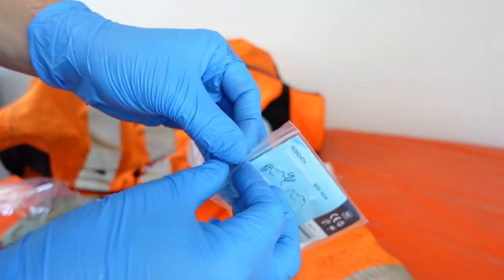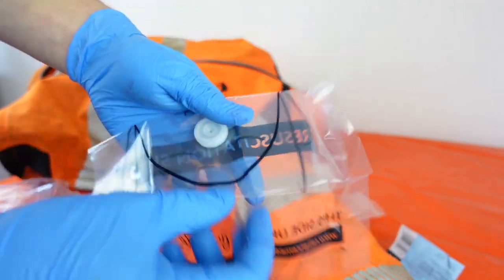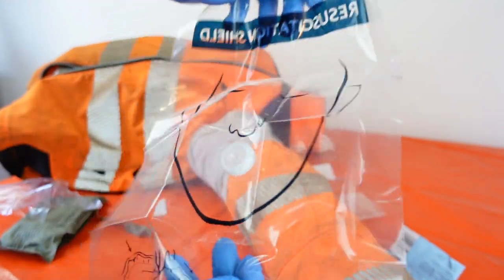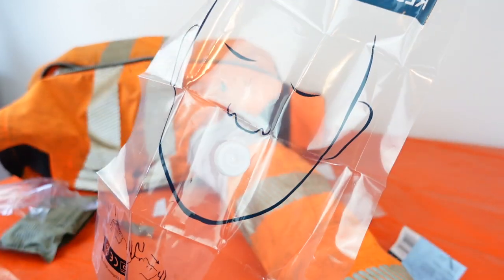The resuscitation aid is something I wouldn't have included myself, but when you look at the size of it, it makes perfect sense. It limits the risk of gross contamination when performing CPR, creating a physical shield between the first aider and the casualty.